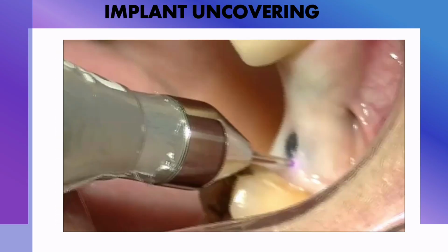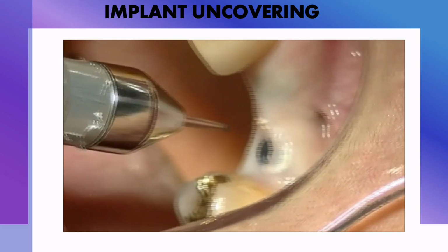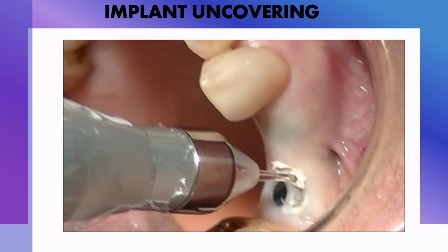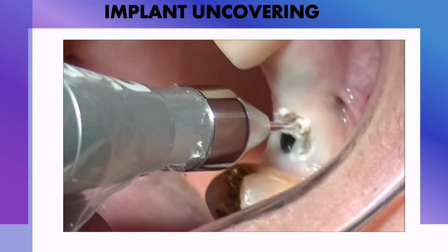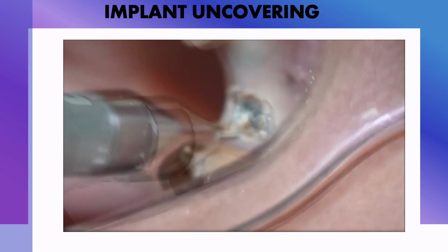Also, a very frequent implant procedure, just like implant uncovering, can be obtained as described in this movie using a newer laser instrument represented by a sapphire monocrystalline tip, which allows the surgeon to pilot the laser beam as using a pen in his hands. After the induction of a moderate amount of local anesthesia, the sapphire conical tip gently draws and uncovers the oral mucosa surrounding two maxillary implant fixtures.